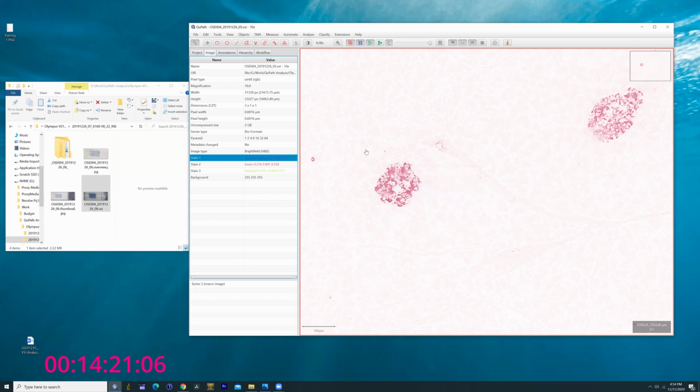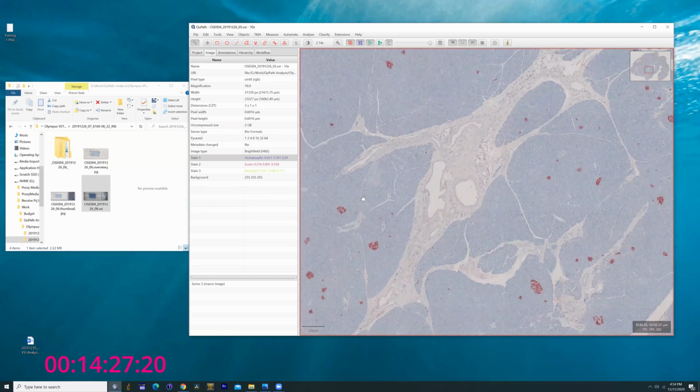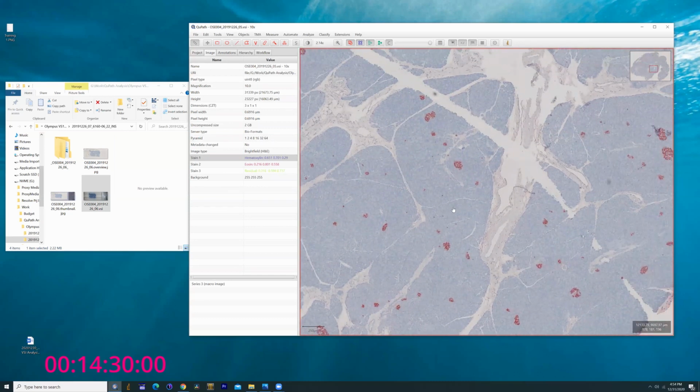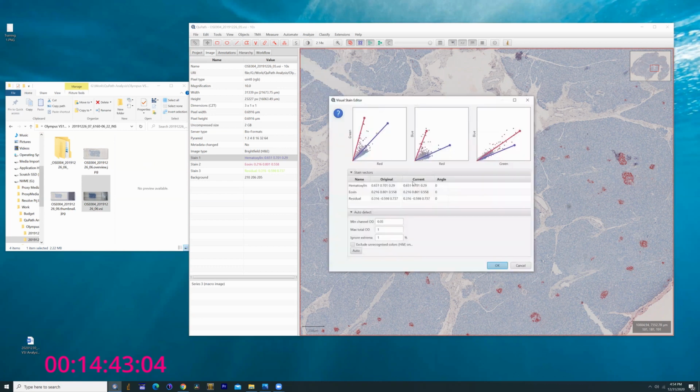Cancel. What I'm going to do is go out and pick an area where we have overlap between the background and the stain. So we want to take a square section with background and stain. Then we can go to pre-process and analyze the vector locations of each of the colors. Basically, these are measurements of where the red and green fall.